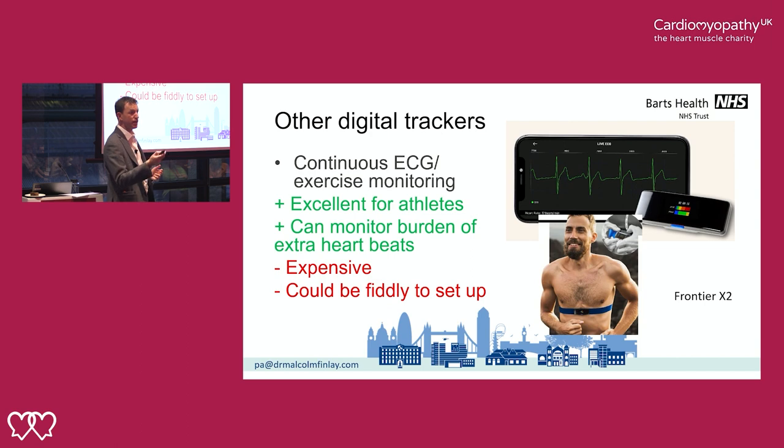There we go. If you're one of the people who has paroxysmal episodes, you can set it to alert. I wouldn't, because it just continues. You've had great experiences there. Yep.